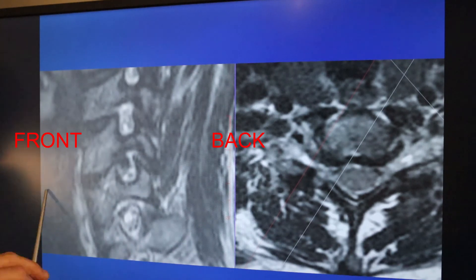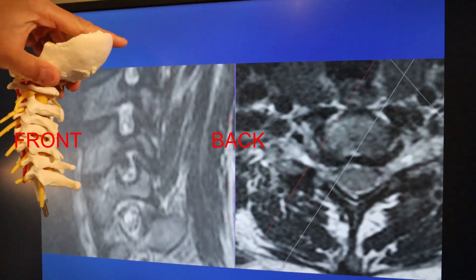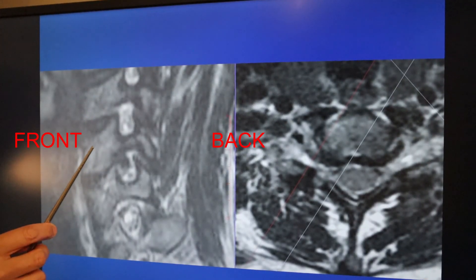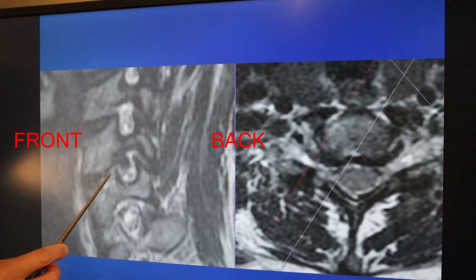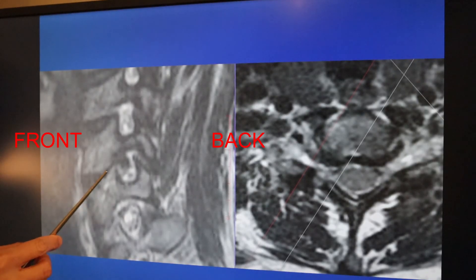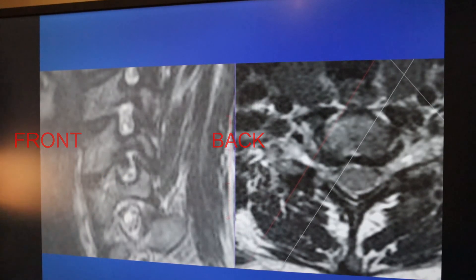This is the back of the neck, this is the front of the neck, and this is the side view. This is the C5 bone and C6 bone. There's a disc and there's a bone spur coming out narrowing this space. The space is supposed to look open, but you can see that there's a bone spur coming from here.